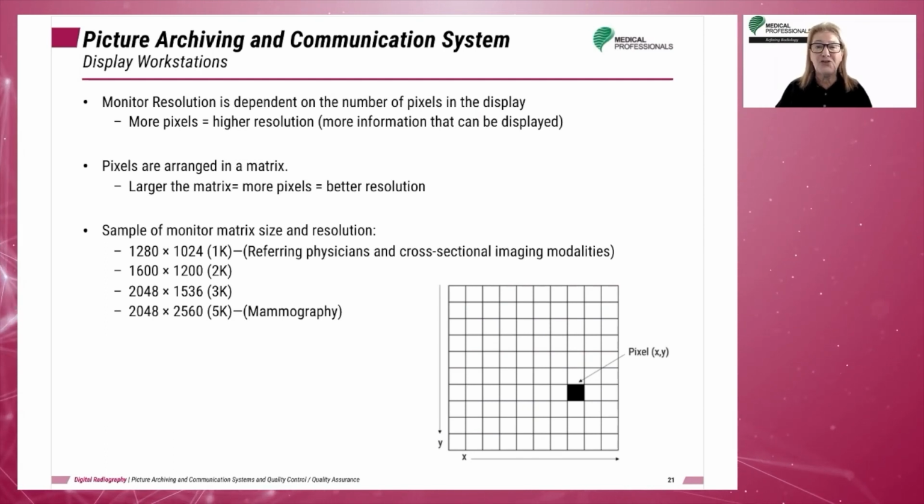Monitor resolution is dependent on the number of pixels in the display. The greater the number of pixels, the higher the resolution. Pixels are arranged in a matrix. A larger matrix size means more pixels, which equals better resolution. Radiologists require the highest resolution monitors for the particular modality.